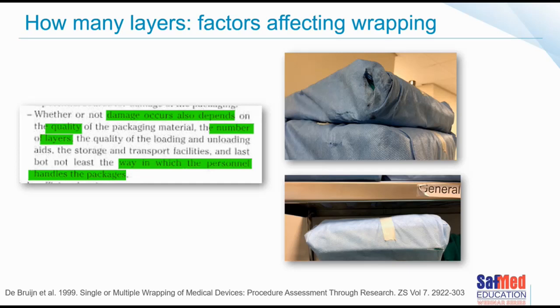We know that if we don't place them at ergonomically correct heights, we don't manage them well. So the guidelines always say that heavier sets should be at around waist height or slightly lower perhaps, and the lighter trays can be packed higher to make it ergonomically easier.